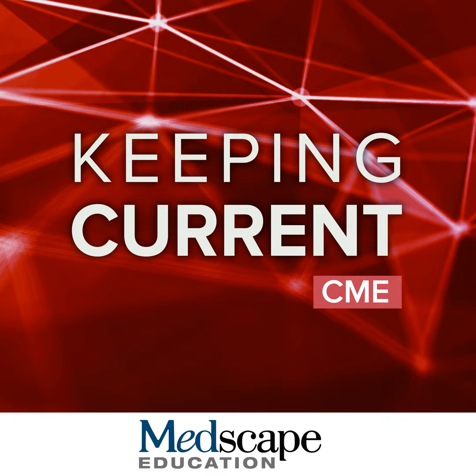By the time we get to transitional phase, we end up having what's called a pseudo washout because the background parenchyma begins to take up gadoxetate, and you can see by 20 minutes the hemangioma looks really, really hypointense. The key to correct diagnosis is to recognize that the enhancement is going to be the same as intravascular pool on all phases. We see this peripheral nodular discontinuous enhancement regardless of the contrast agent we're going to use.